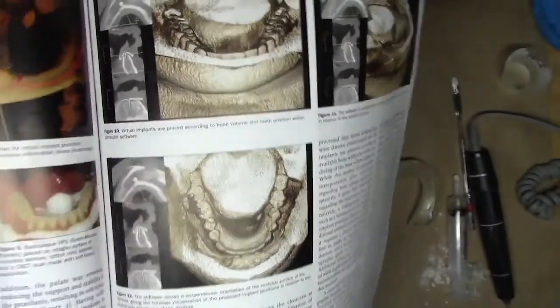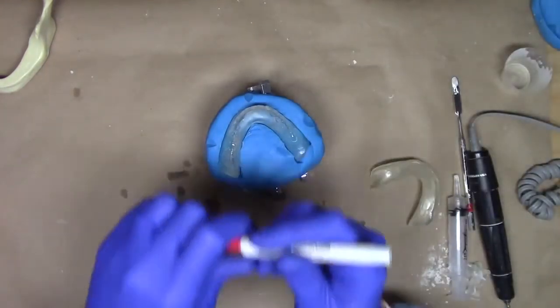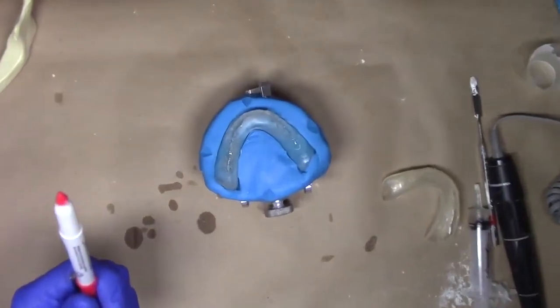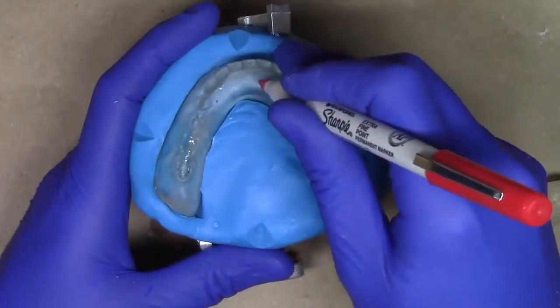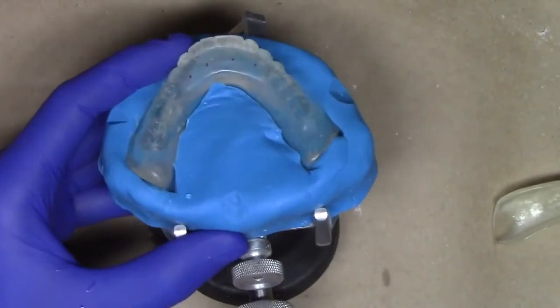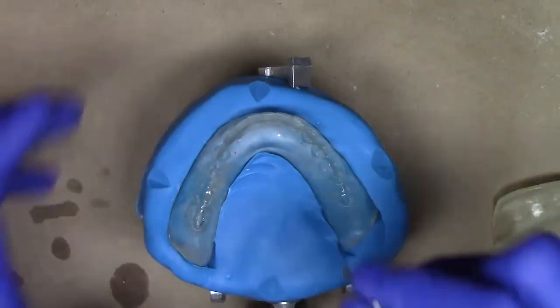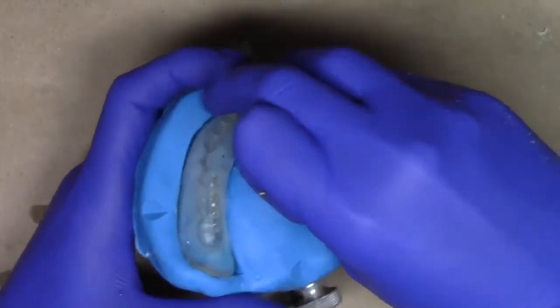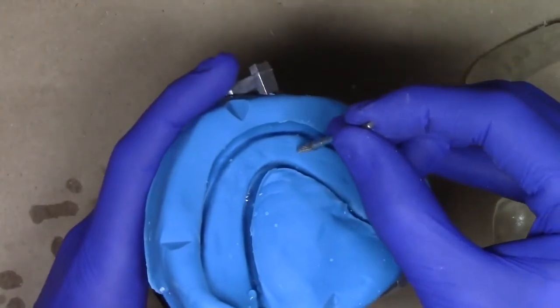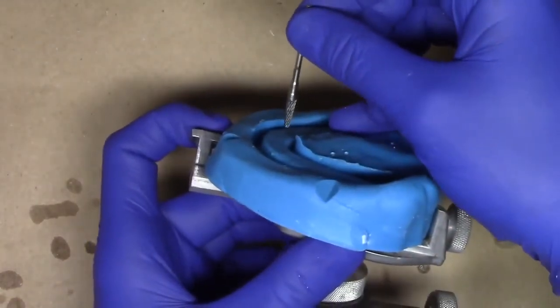What we like to do is take these 4 marks, and what I'm going to simulate is just grabbing a Sharpie type instrument. Now let me zoom in. Let's say this simulates my 4 LODI implants approximately there. What you'll do with the drill press, with your LODI drill, is take the drill press until you match up this position as well as when the denture's out of the mouth on the ridge. When it's on the drill press, my drill press is looking just like this, up and down, or from a side profile, up and down.